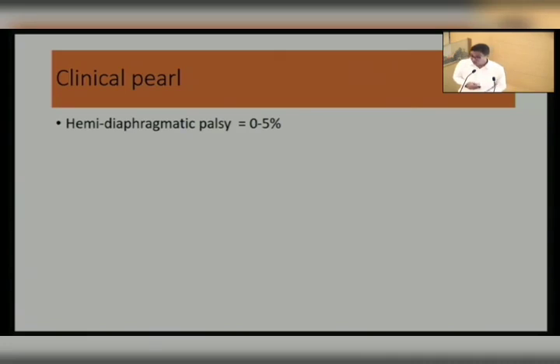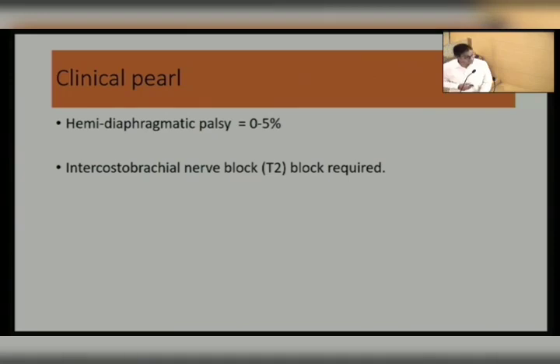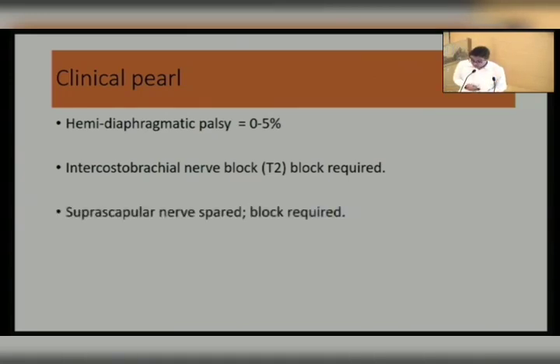Hemidiaphragmatic palsy is almost 0% or up to 5%. Few reports are there which show that palsy is there. Again over here we require a T2 block, and in this approach the suprascapular nerve is mostly spared. So if you need traction for orthopedic surgery and you apply this block, then you require a suprascapular nerve block, because that will create shoulder pain when they distract the fracture, right? So you have to use your block wisely depending on the surgery. For a simple debridement, it is okay, but if they want to distract the fracture, then the patient might have shoulder pain. So use the approach of that particular block wisely.